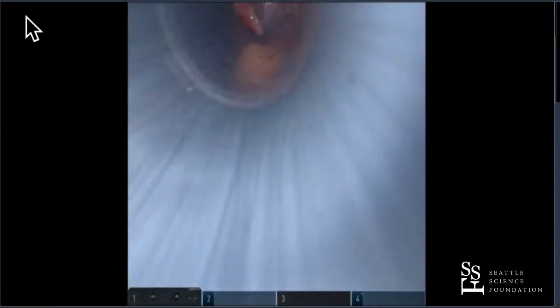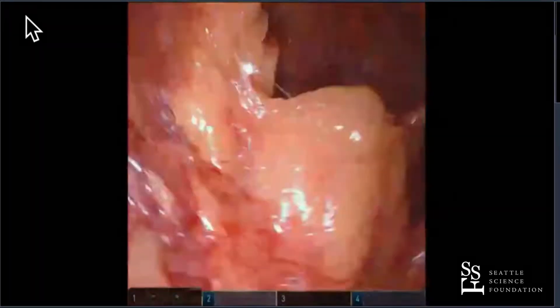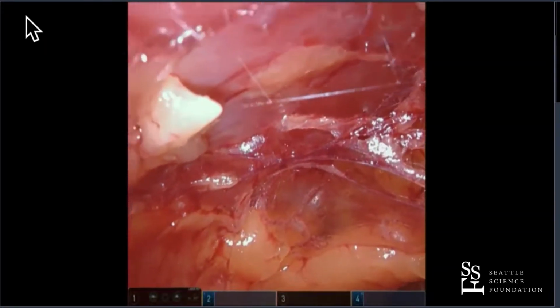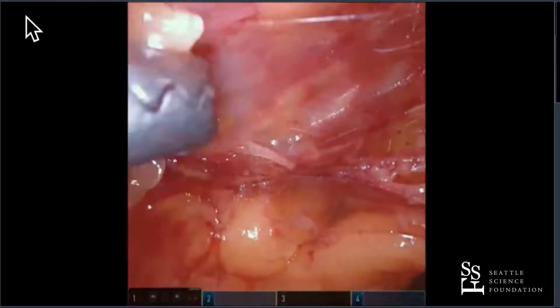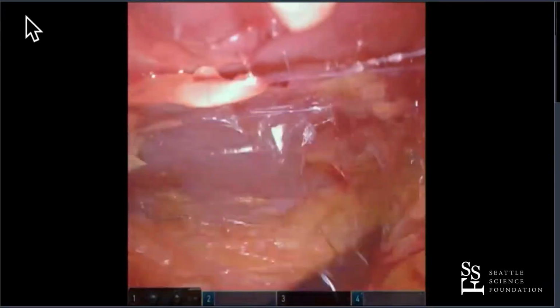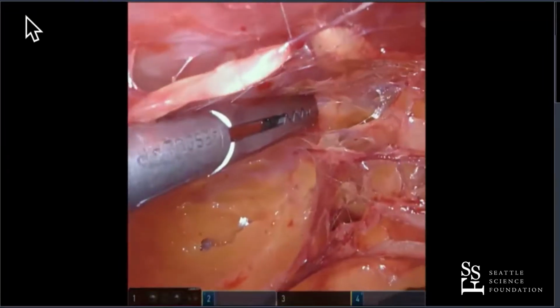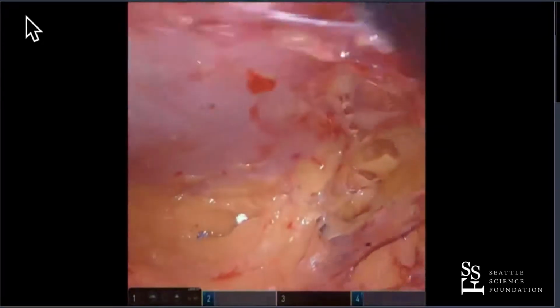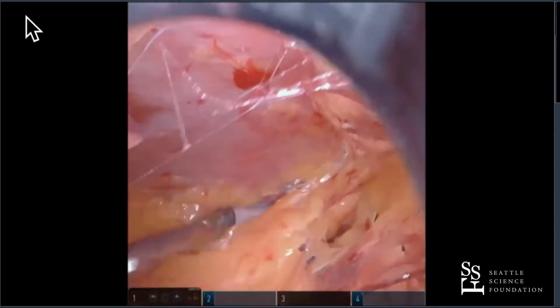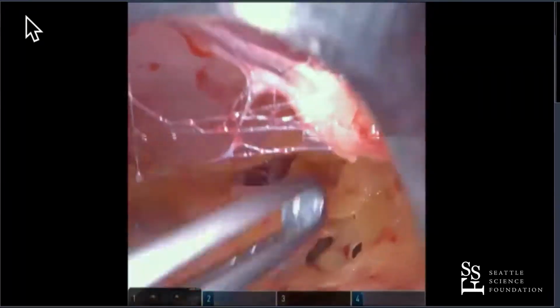All right, and Terry, I may need you to come over here and help. Okay, so now what we're going to do is we've got 30 down. I'm going to turn it upside down, and now I'm going to start with my instrument here, and I'm going to start pushing off. I'm just going to start to see where things are. And what I'm starting to see is the transversus abdominis muscle here. Terry, why don't you hold the scope for me? Hold that port, Brando. I'm going to pull back. Perfect. And I'm just going to start pushing off here. And there's peritoneum right there. You'd like not to put a hole in that. Go to the right, Terry, if you can.